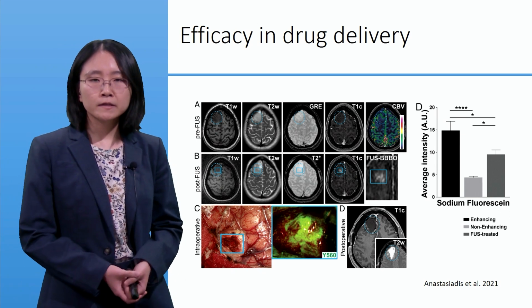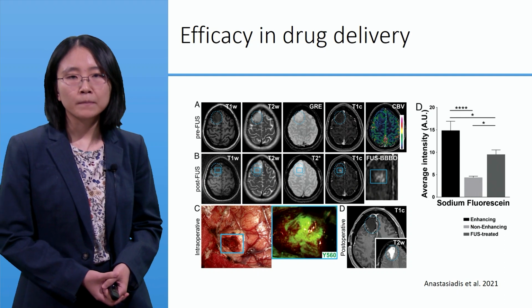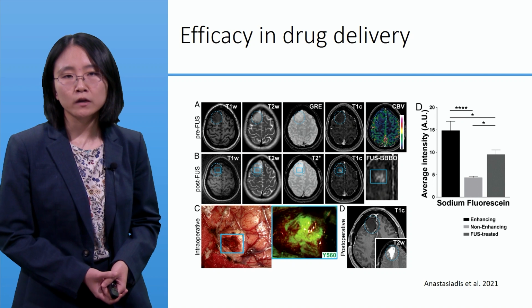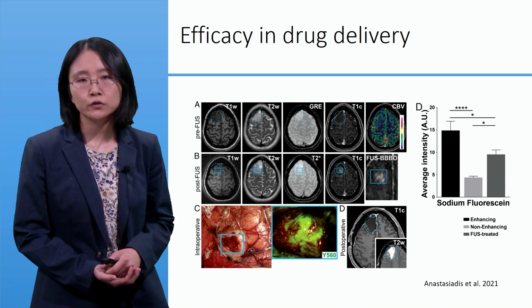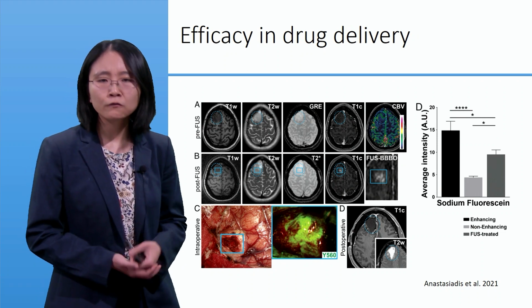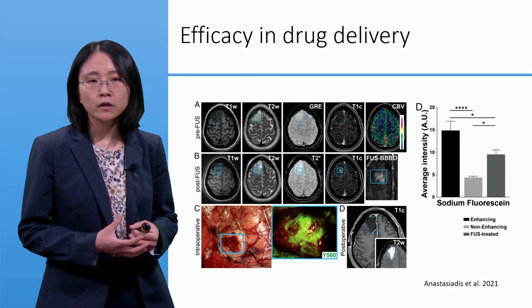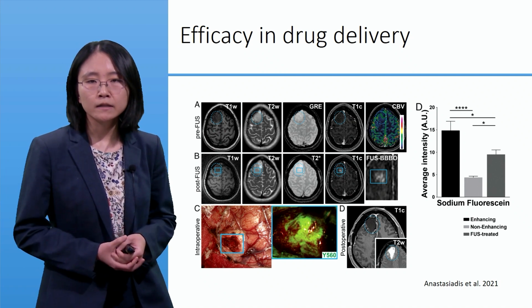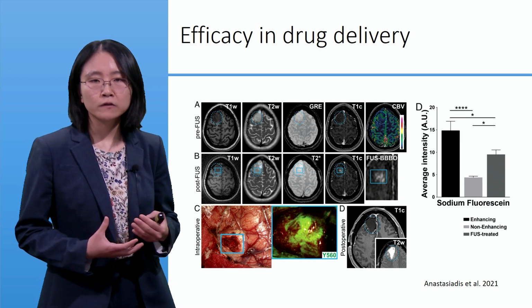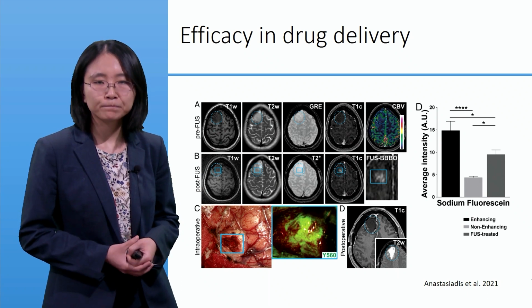This is another study that hopes to answer the same question using fluorescein. Patients with brain tumors underwent a procedure where a non-enhancing portion of their tumor was sonicated in order to open the blood-brain barrier. Fluorescein typically is used to highlight high-grade gliomas where the barrier is already leaky, and is used to allow surgeons to achieve a better gross total resection of these high-grade gliomas.